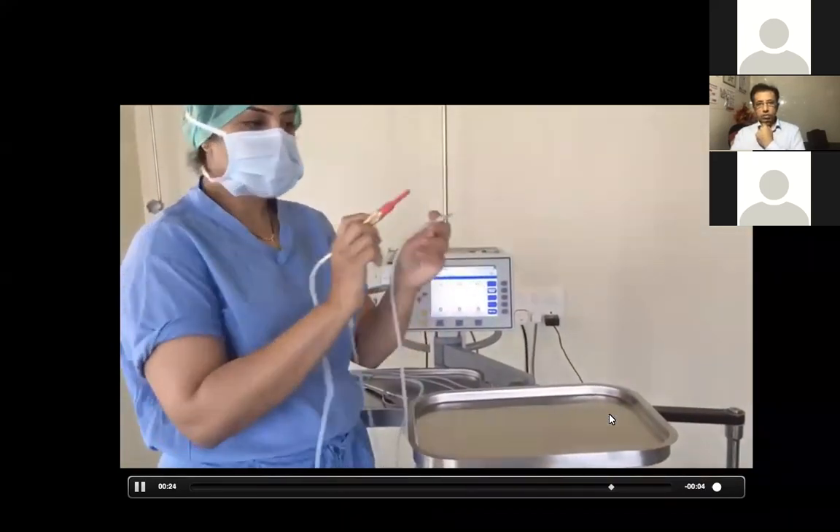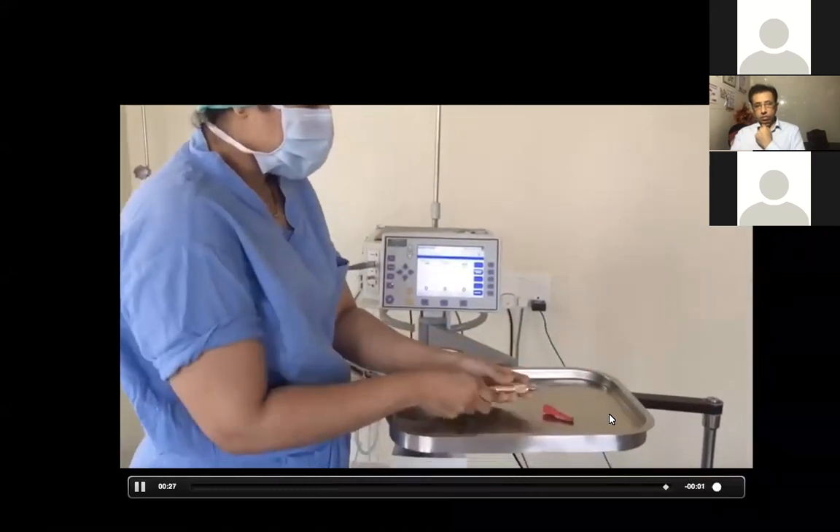With one hand you irrigate and the other hand the vitrectomy probe will be doing the cutting and aspiration. The probe is 96,000 rupees. For sterilization, I generally ETO it from a higher center and keep it for emergencies. Where I can't ETO, I autoclave it. It is autoclavable, but they recommend ETO for better probe longevity. The maximum cut rate with this cutter is around 900.